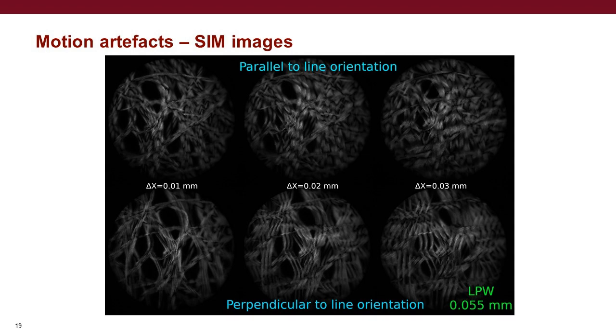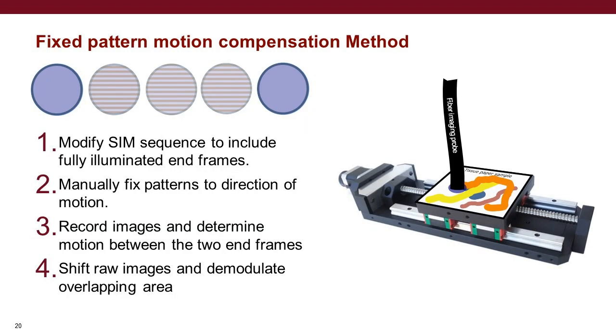When you have motion, and that motion is parallel, you start to get this blurring. And when you have motion that's perpendicular to the line orientation, you get blurring again and chopping, and these fixed spatial frequency artifacts. You see a lot of repeated features. And those won't allow mosaicking to succeed, and the images are going to look very blurred and chopped.